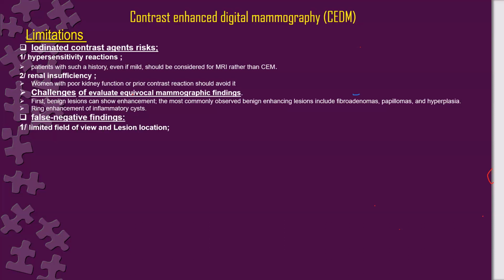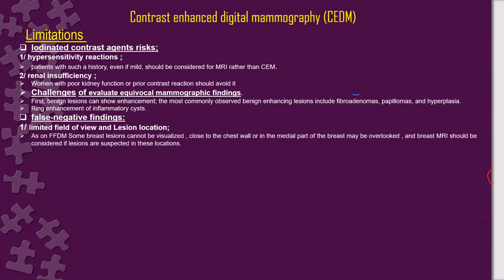Also, the false negative findings by a limited field of view and lesion location. If the lesion is in the extreme posterior medial breast, it might not be included in the field of view, and on full-field digital mammography, a lesion cannot be visualized if it is close to the chest wall and so forth. And contrast enhancement does not enable evaluation of the axilla and local nodal regions.